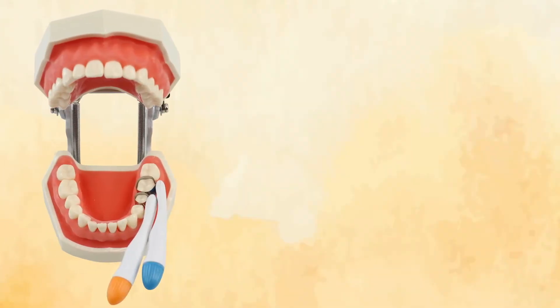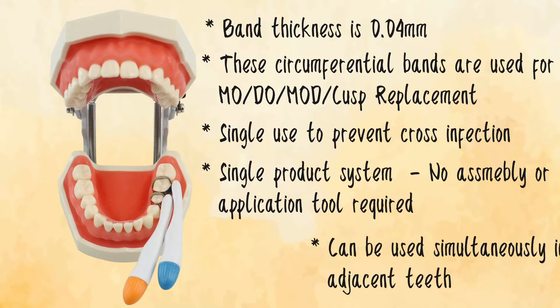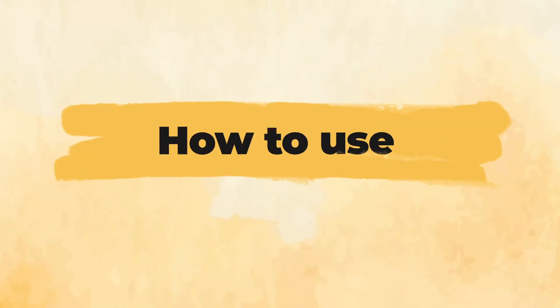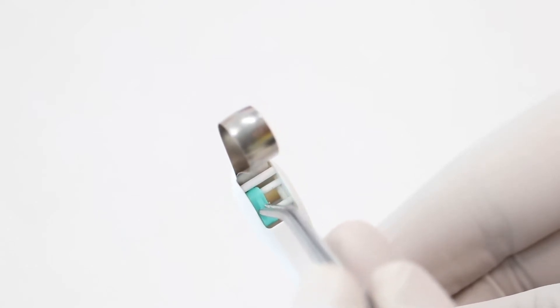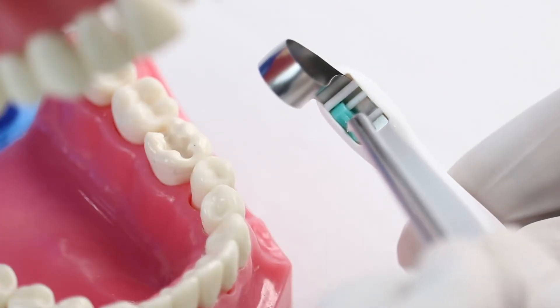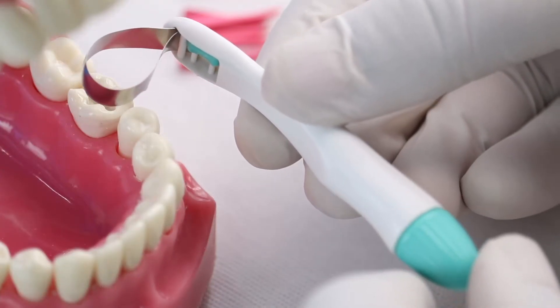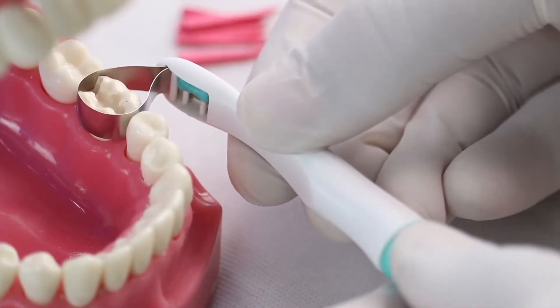Superindo Automatic Matrices can be placed around the tooth so effortlessly in comparison to the conventional matrix band and retainers. The toggle should be positioned closest to the gingival margin to ensure correct fit around the tooth. Before use, adjust the toggle to suit the mouth quadrant in which the automatic matrices is being used. Place the band around the tooth and tighten by turning the thumb screw clockwise.